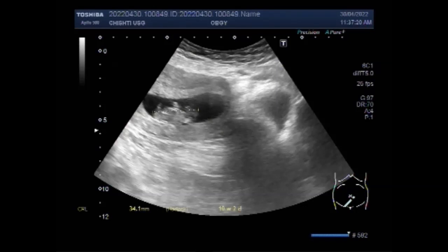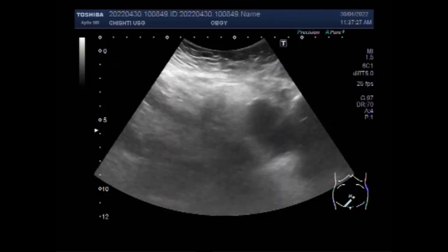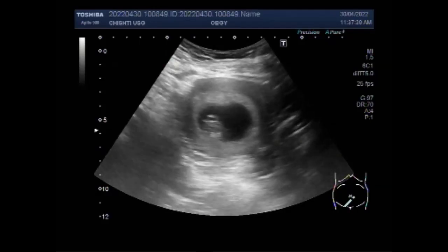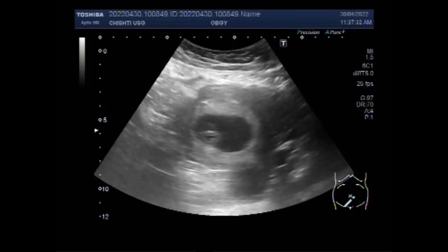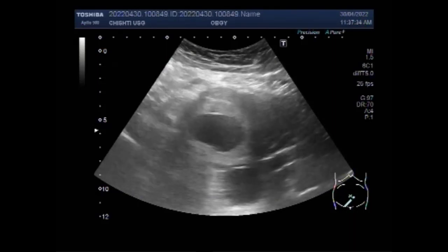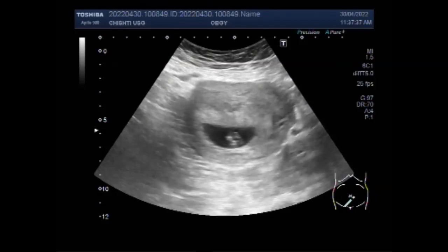You can see the fetus — the pregnancy is slightly more than 10 weeks. You can see the fetal movements and fetal cardiac activity.